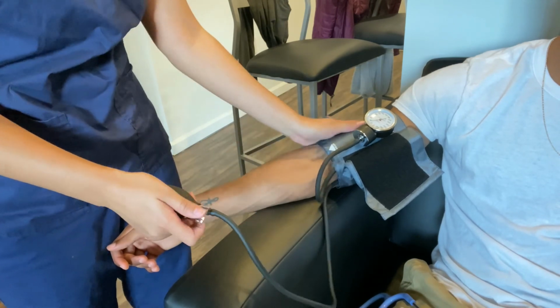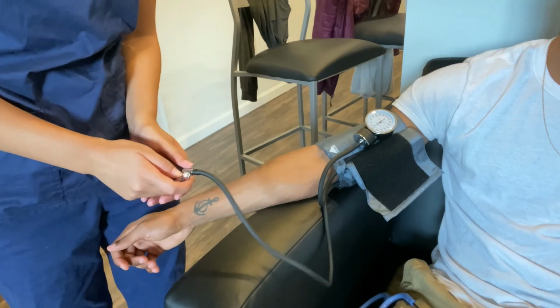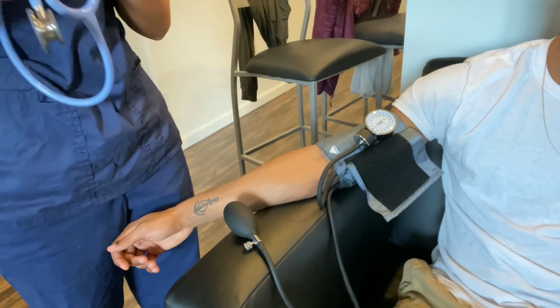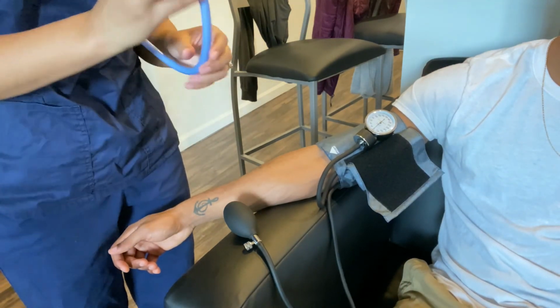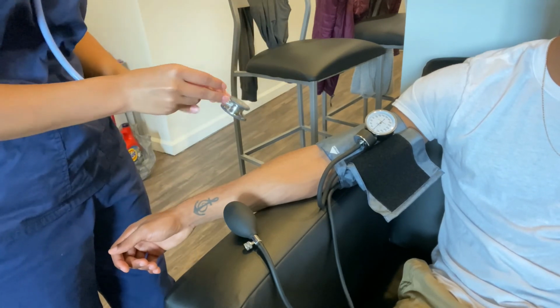So you want to deflate the cuff. And then you want to add about 20 to 30 to that to repump the cuff. Give the person some time for their arm to relax after deflating the cuff. I'm going to take my stethoscope. I'm going to place it on that pulse that I just felt.